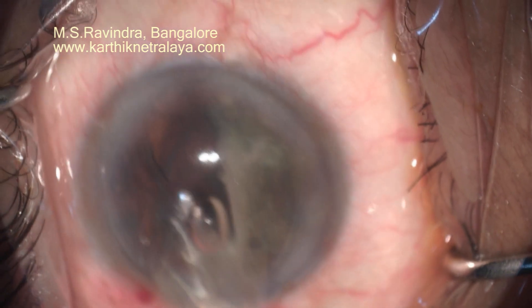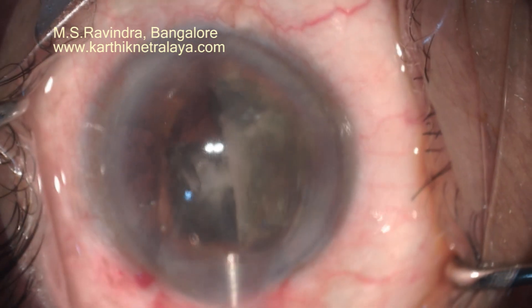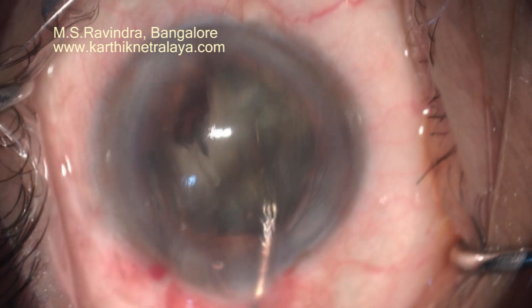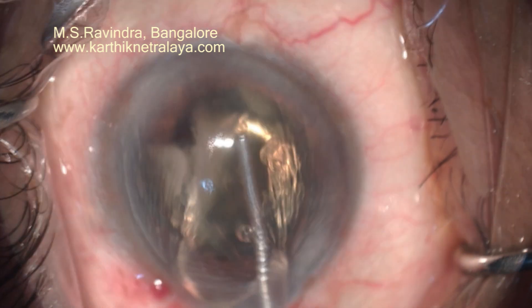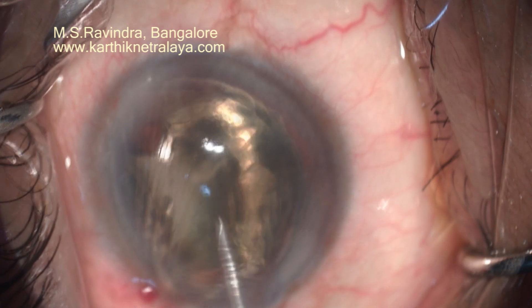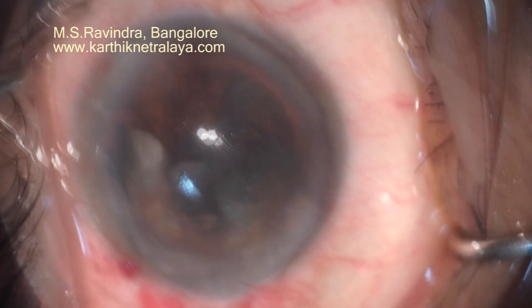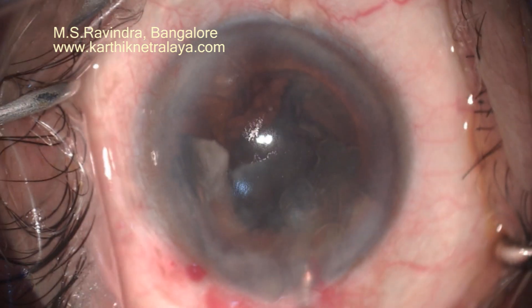This will minimize further damage to the zonules if any zonular dehiscence is already existing. In glaucoma patients, especially those who have had trabeculectomy, there are known to be weak zonules and there could be capsular dehiscence during surgery — this technique will totally avoid that.